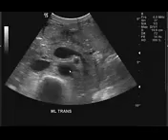So on this image we see the anterior-most structures is not very well seen because this is part of the stomach. But here we see an anechoic area that becomes larger as it approaches the right side. This is the splenic vein. So in front of the splenic vein is the pancreas, because the splenic vein is located on the inferior margin of the pancreas. Behind the splenic vein is the superior mesenteric artery, the aorta, and the cava. So in ultrasound, areas that are fluid containing are anechoic.